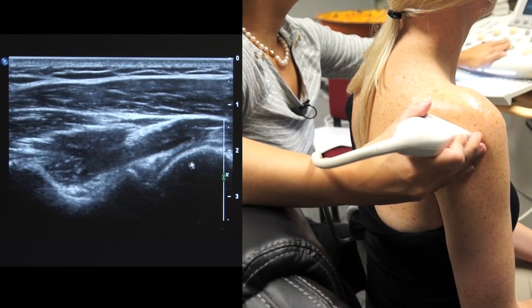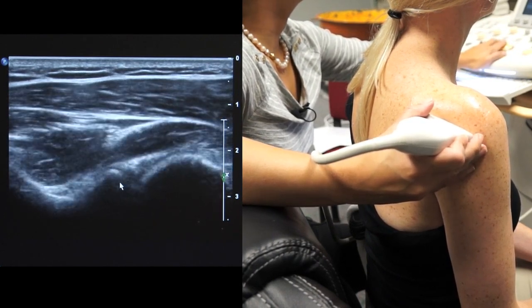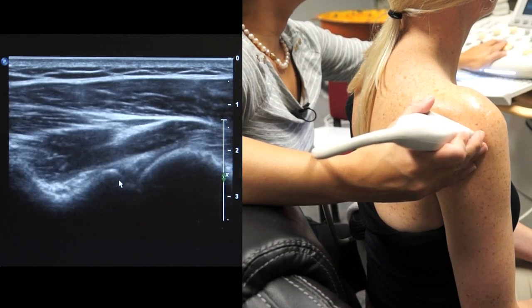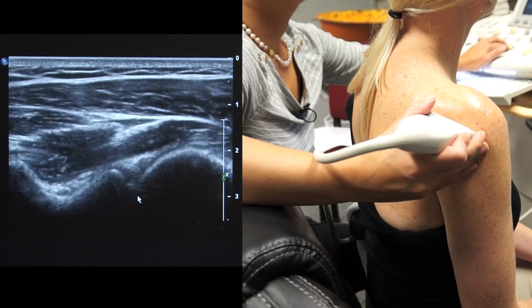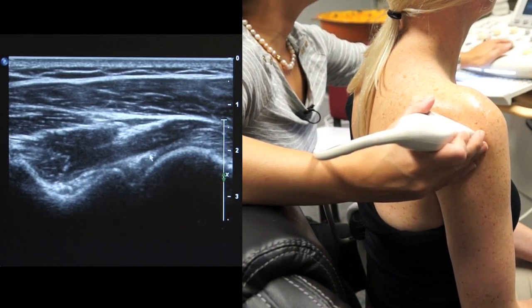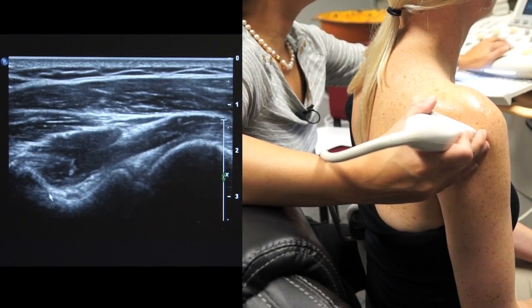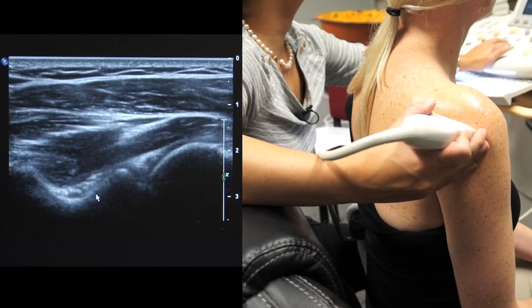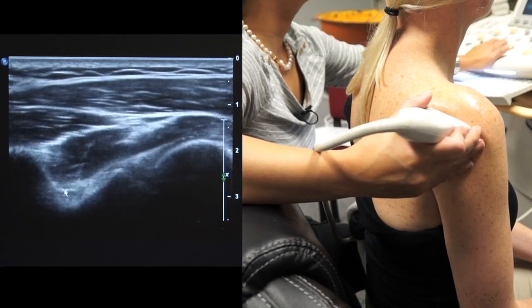Now here, we are looking at the humeral head, and here is the glenoid, right here. Here's the glenohumeral joint. This triangular structure is the glenoid labrum, okay? And right here, we are looking at the spinoglenoid notch, and that's where the suprascapular nerve sits.